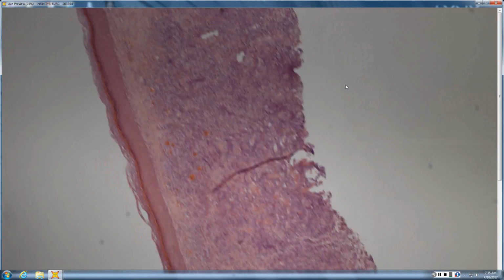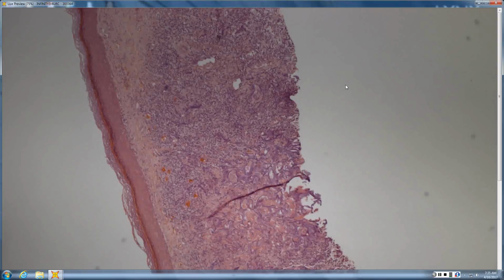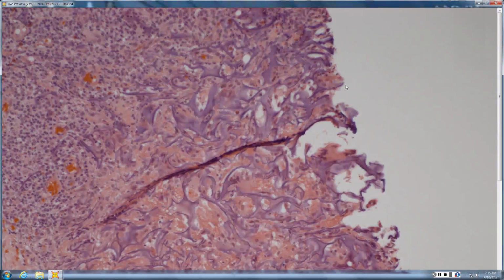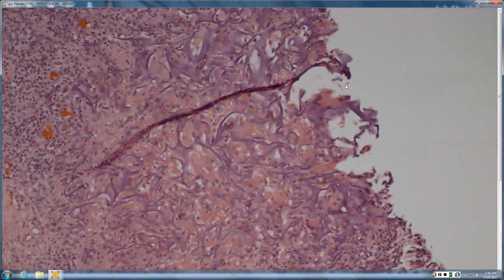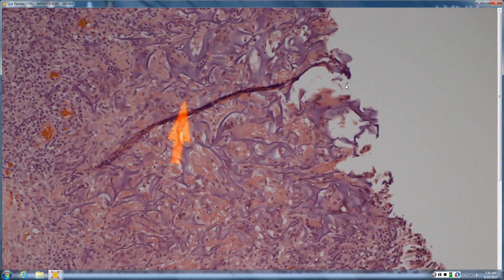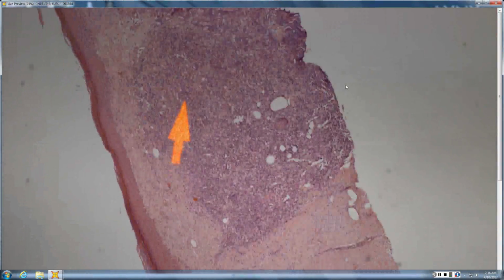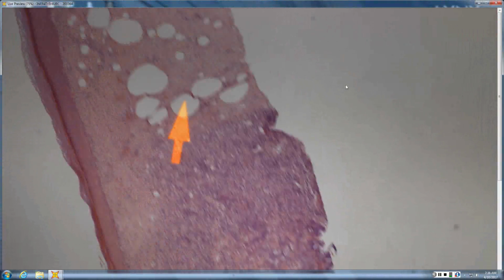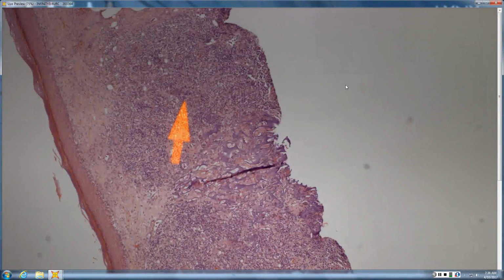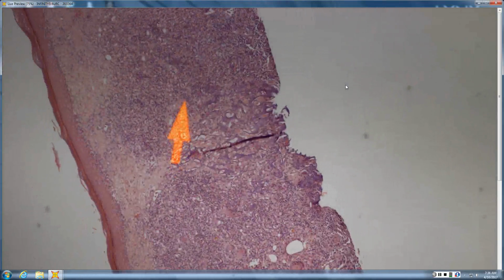So you have a busy dermis, sort of locally. Looks like there's some collagen trapping. But kind of looks like gel film. Yeah, exactly. So you have multinucleated giant cells, and all of this gray squiggly stuff is gel foam, so you're looking at a biopsy site, basically. There's no tumor, there's scar on the two sides, there is granulomatous and lymphoid inflammation, and there's gel foam in the center.